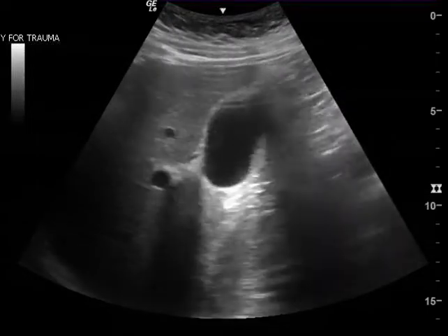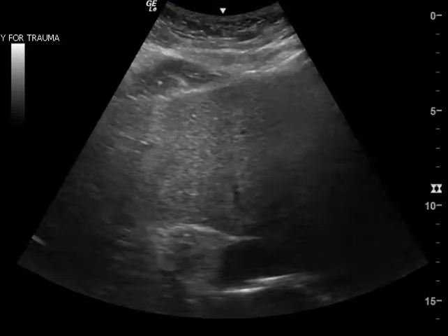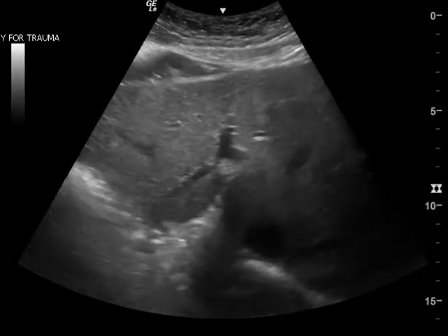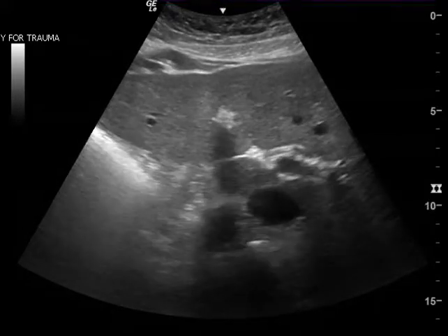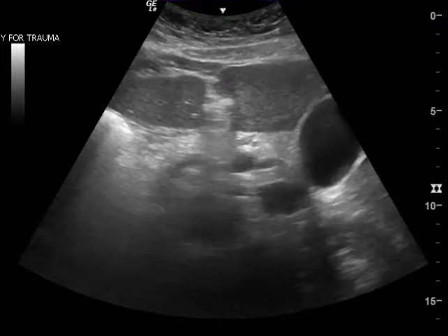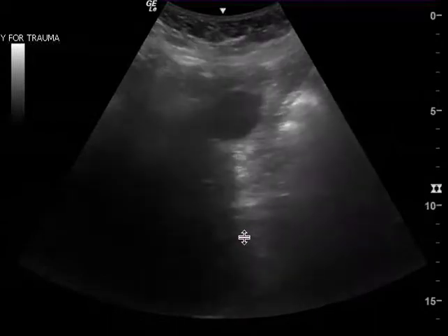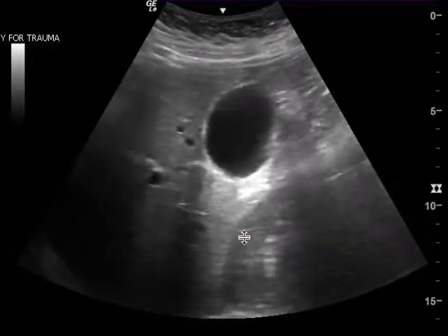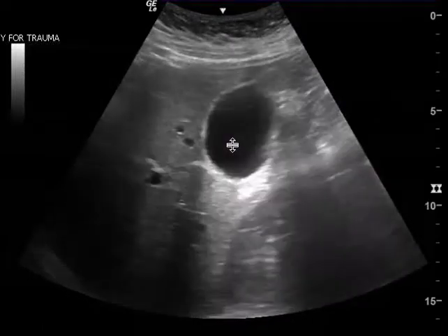The other thing is that when you're doing a gallbladder ultrasound, I need to see the gallbladder in multiple planes. The clips you have saved are both in the same long orientation. I would like you to also turn the probe 90 degrees so I can see the gallbladder in a different orientation — that may have made seeing the stone a little bit easier.